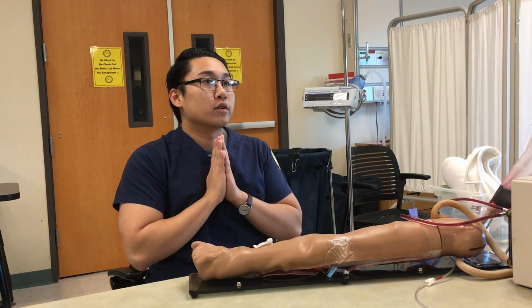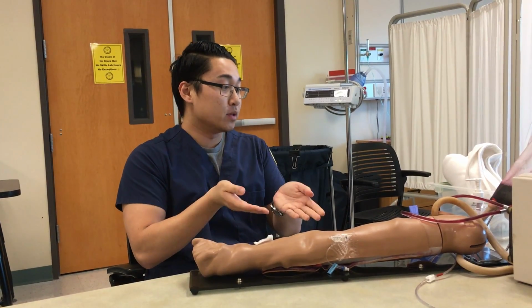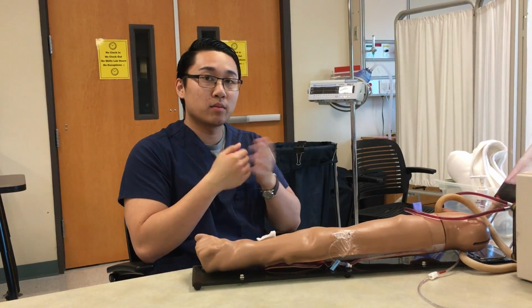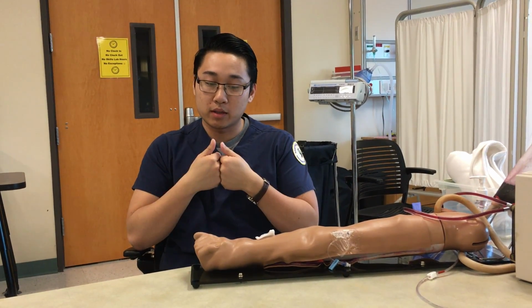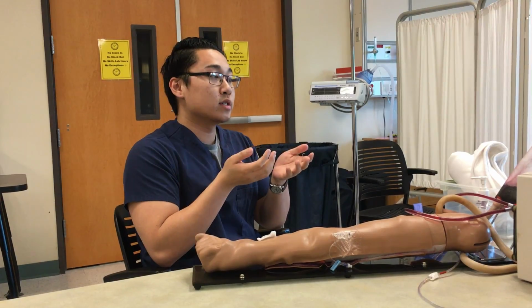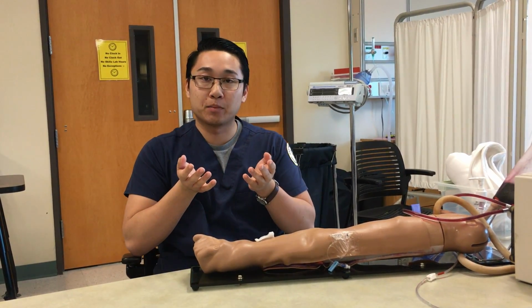So 3 non-invasive alternatives to an ABG would be a transcutaneous blood gas monitor, capnography, and pulse oximetry. And there are reasons for variation in sample size.